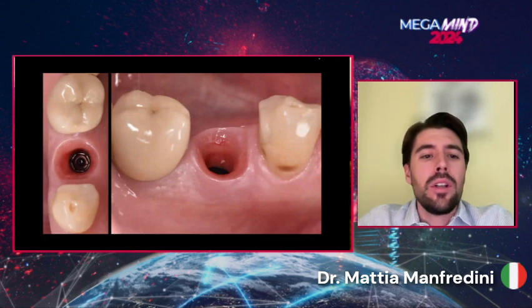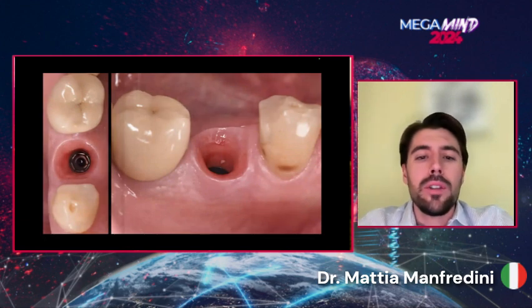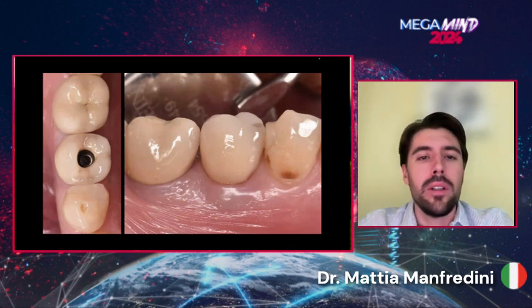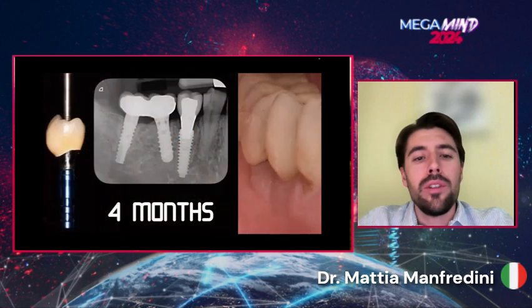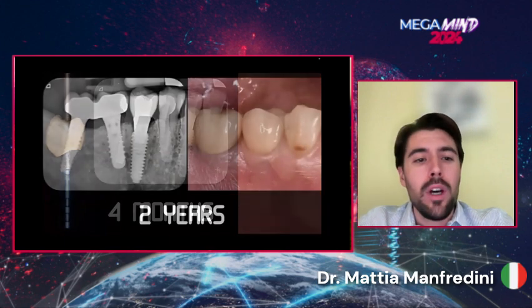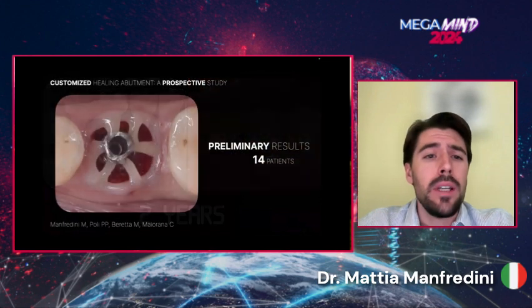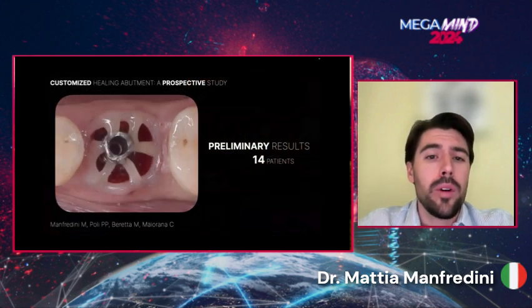These are the tissues on the delivery day, where a correct amount of soft tissue height and thickness is present, and this is fundamental to avoid any kind of resorption around the implant. And the final prosthesis where, according to the protocol, data on the pink and white aesthetic score are collected. We are now at 4 months in this picture, where the stability of the hard tissue is also remarkable. And here we can see how this stability is maintained at the 2-year recall of this patient.